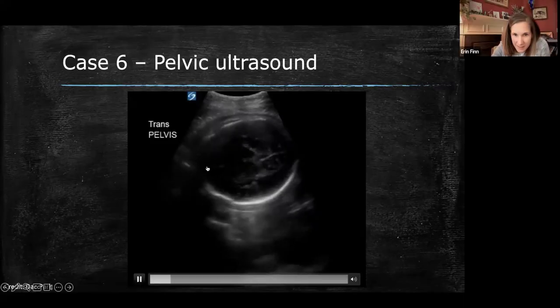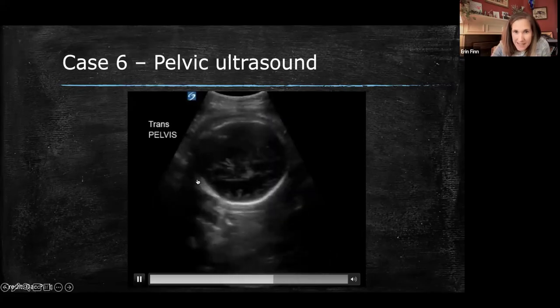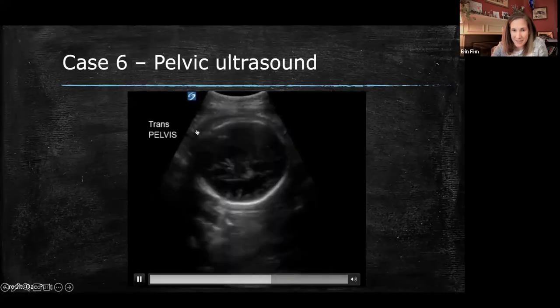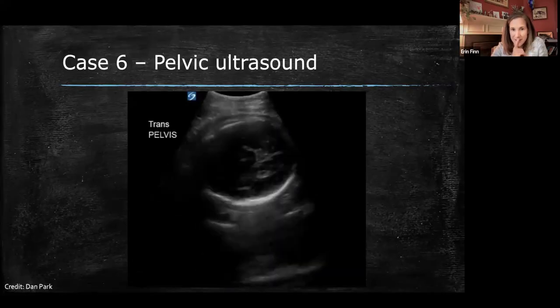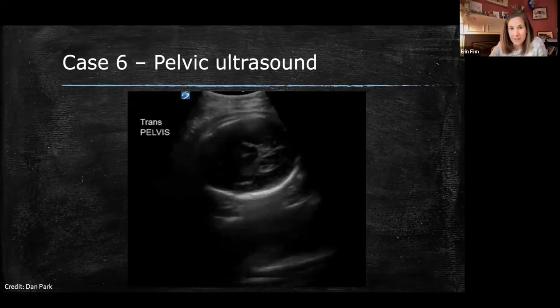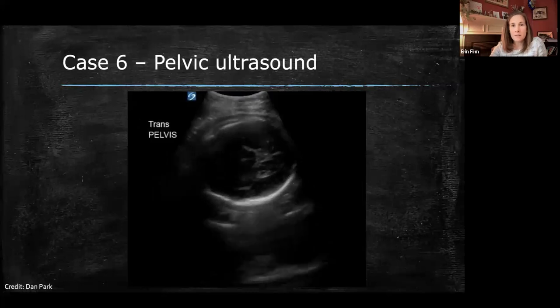Those are great thoughts. And I'll tell you, you're not actually seeing the bladder very much here. So what else could we be looking at? Could that be a large bowel, like colon expanded or full of stool? That's a great thought too. So when we were walking through the female pelvic region, when Ajay was fanning back and forth, what structures were we seeing? So we were seeing the bladder, and then what else?